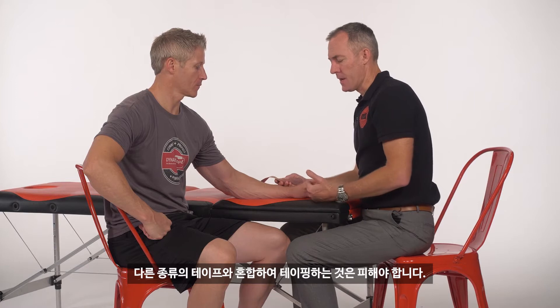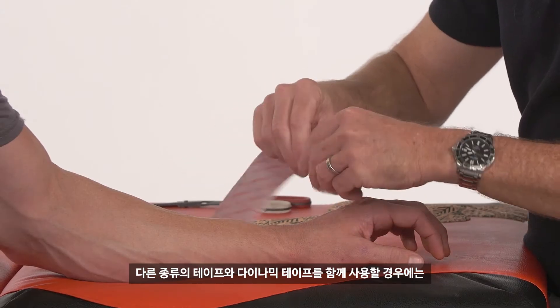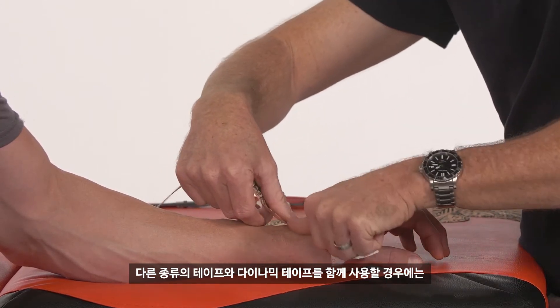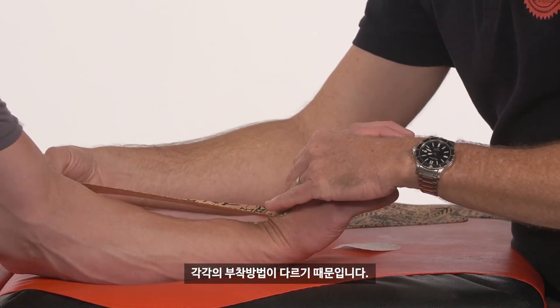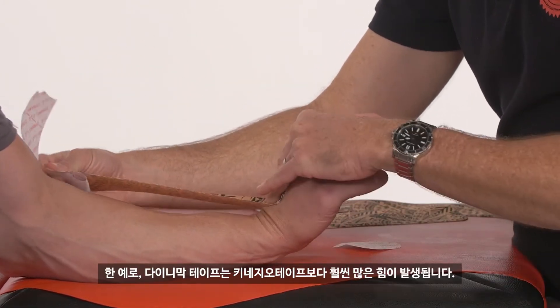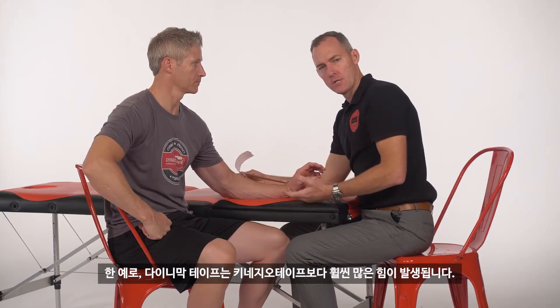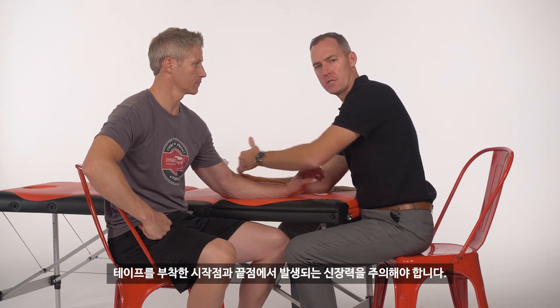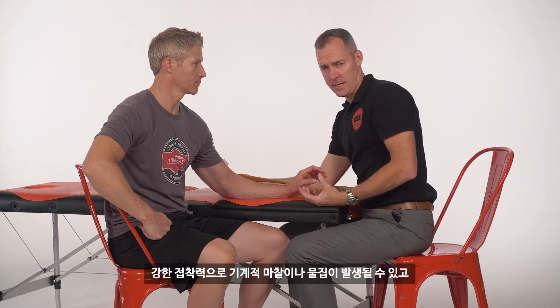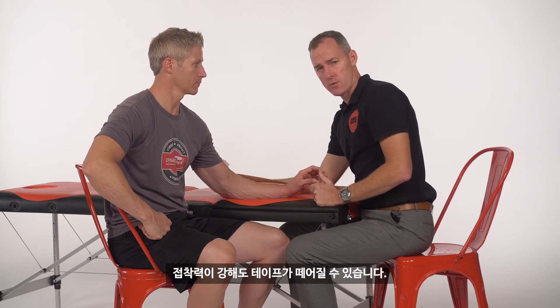Avoid bridging type techniques that you may have done with other tapes. With dynamic tape, bridging means where we have one end on, we shorten things up, and then we place the other end on. The reason being the forces are much much higher in dynamic tape than they are in a kinesiology tape, and so by putting those two points on first we really start to focus the attention on those two ends and we're more likely to get a mechanical irritation, a blister, or see that the tape wants to lift off, despite having a much stronger adhesive.